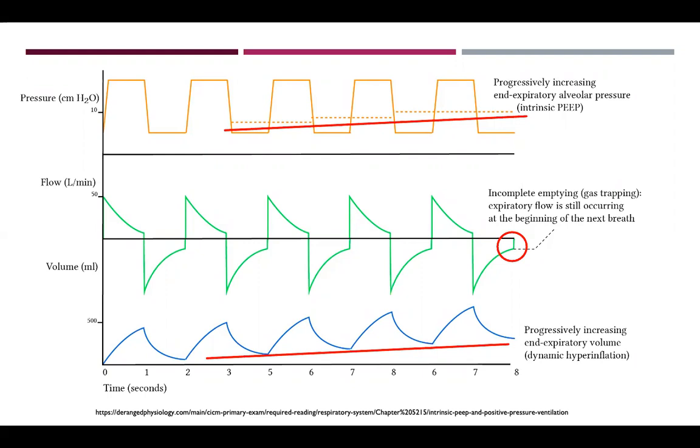Or as I said, you can just look at the graph that is being plotted by the ventilator and see if the nadir comes back to what you set it at. Mm-hmm.